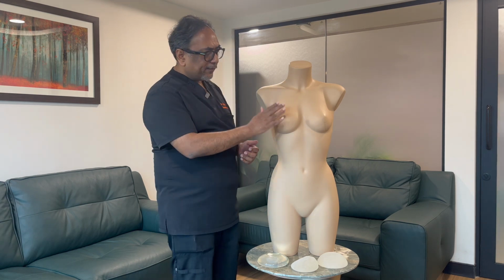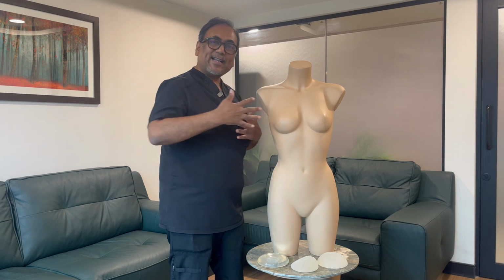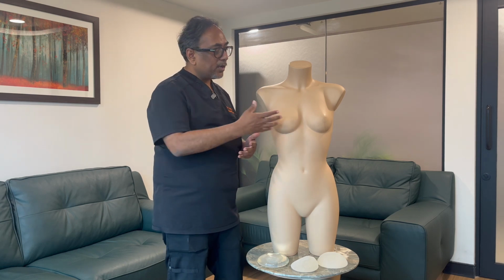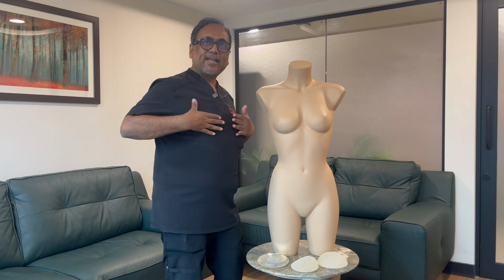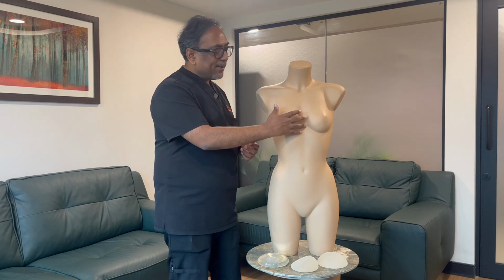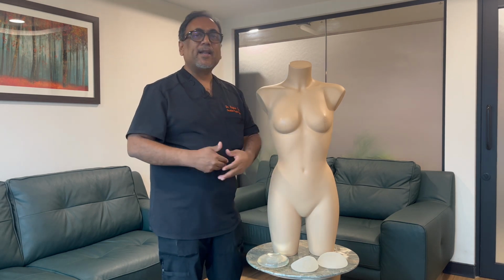Not only the base width, we also see how much the skin stretchability is, because very tight-chested patients may not permit us plastic surgeons to put very big implants. So that's not a possibility in patients who have very tight skin on the chest. On the contrary, you might also find patients who have very loose skin. Whenever the patient has loose skin, it might permit us surgeons to use a bigger implant.